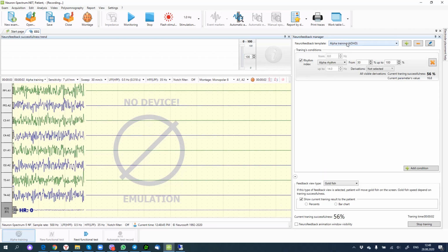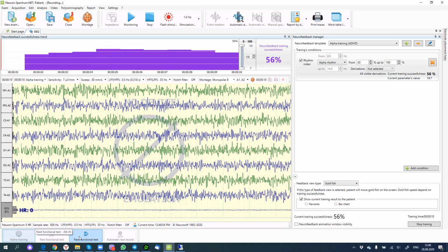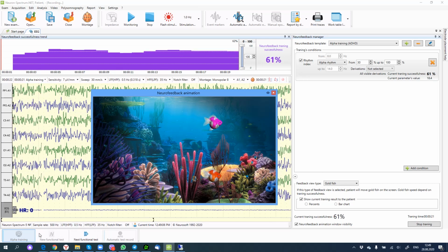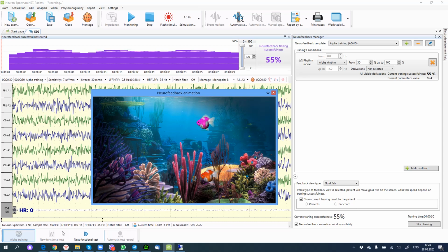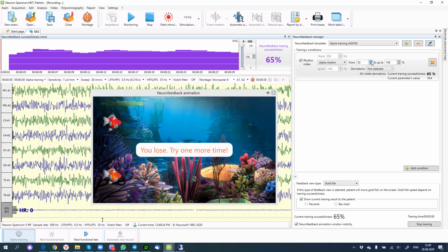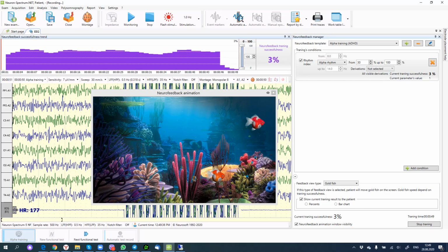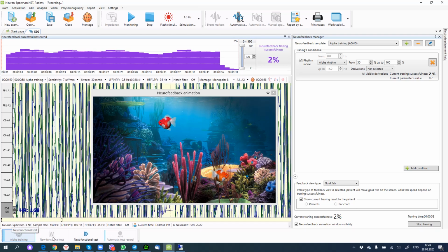You can see now alpha training was started automatically, and here you can see the progress bar. Manually you can change it, for example, and start a new functional test after that, and so as I show, you can create very difficult scripts of different neurofeedback trainings for your patient. It's quite a flexible mechanism where you can set up any parameters, before acquisition, before training, both during, and you can review it after training. Here you can see the progress bar of the current test, and here on this button you can see the progress bar of the whole script, including all your selected tests.